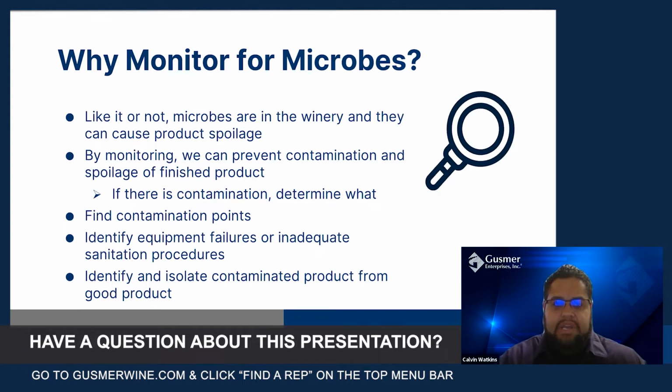And if there is a contamination, we can determine what it is. So that's helpful. Monitoring allows us to find contamination points in the winery. It allows us to identify equipment failures or inadequate sanitation procedures. And it also helps us isolate contaminated product from the good product.